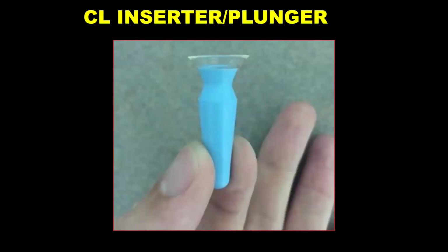Now the insertion. This is the very last part of it, and we can start rounding up now. For lens insertion, one of the reasons practitioners do not practice scleral contact lenses, or rather, that patients get discouraged from wearing scleral contact lenses, is because of the insertion.